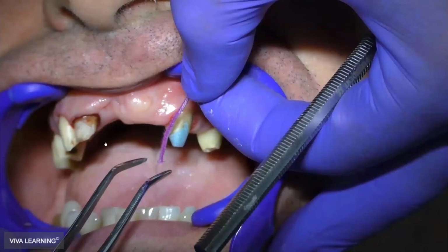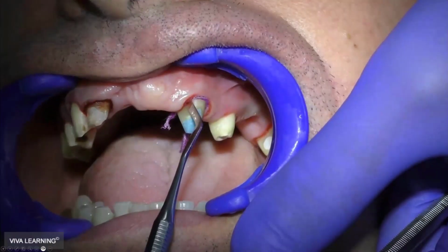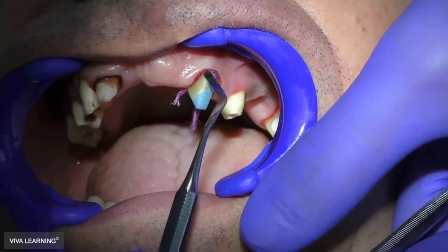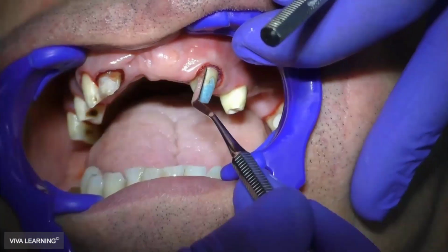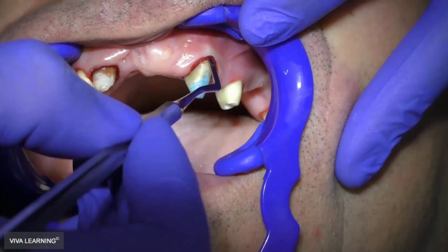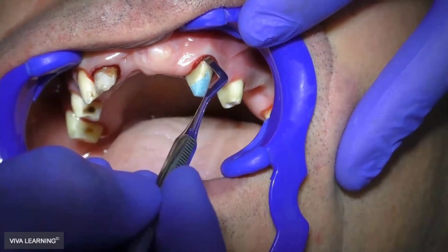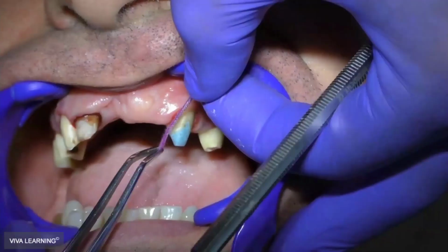So, like in this case, for this canine, you see here the biological width. It's really small. You cannot place the retraction cord without breaking ligaments. If you want to put a retraction cord in there, you can, by putting a lot of pressure, but that will be a bad idea because you are breaking the ligaments, then you are cementing the final crown. And after a while, because the gingiva will heal, usually you'll end up with a permanent gingival recession and with a black margin. Or if the gingival biotype is a thick one, you'll end up with a periodontal pocket, which is even worse in my opinion.